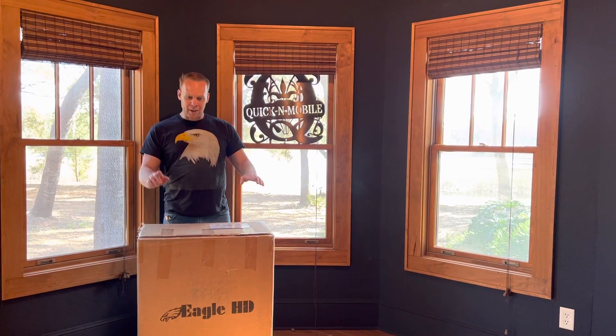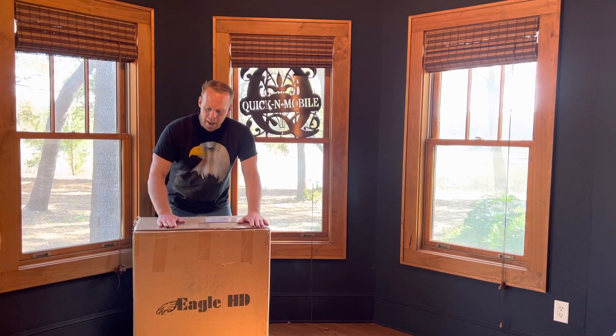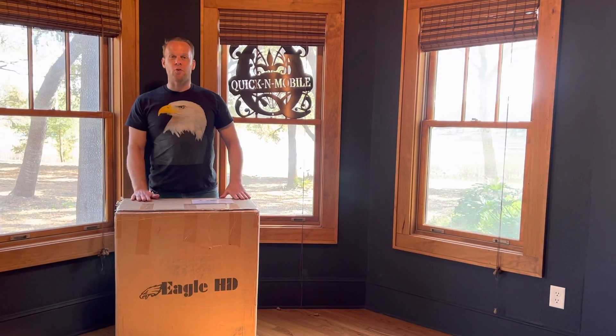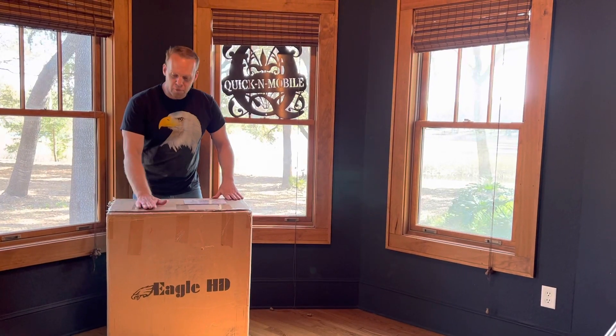Hello, this is Paul from QuickenMobile.com and I am here about to unbox a 2022 model Eagle Power Folding Wheelchair.